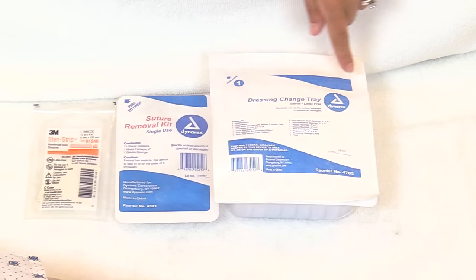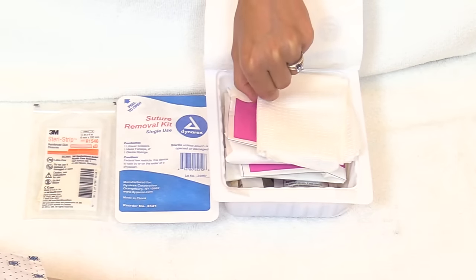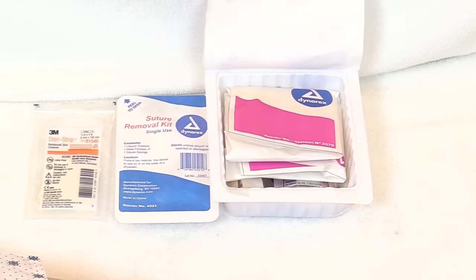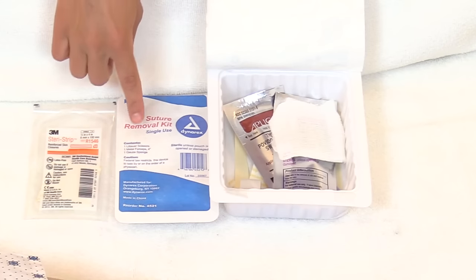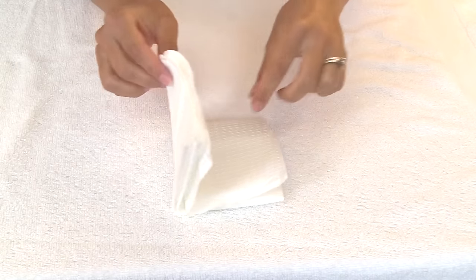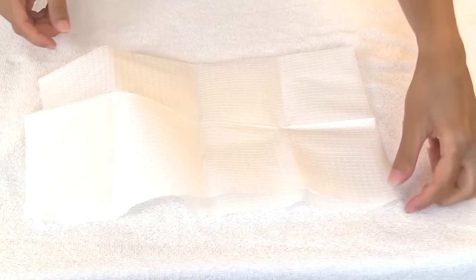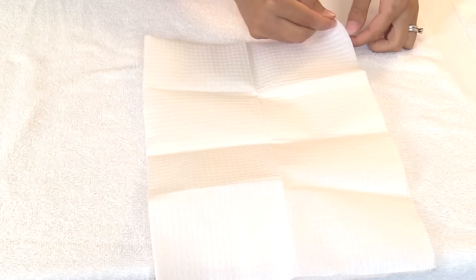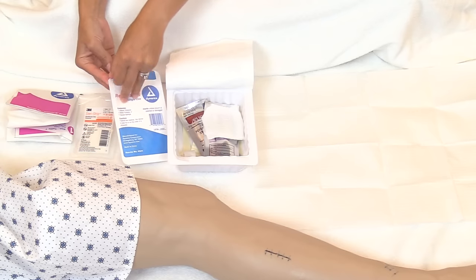Then doff your gloves, perform hand hygiene, and prep your supplies. Open up the dressing change tray. On top is usually the sterile drape — grab it and lay it out — along with the sterile gloves. Open the sterile drape and drop the suture removal kit supplies and steri-strips onto it, keeping everything as sterile as possible to help prevent infection. Gently open the drape, leaving about two inches on the inside to work within.